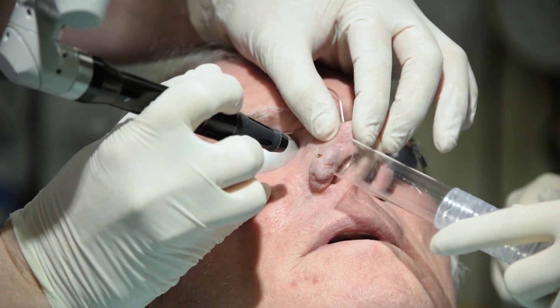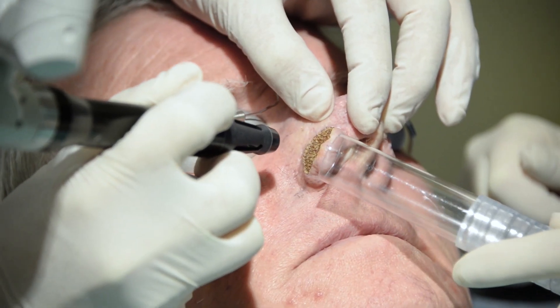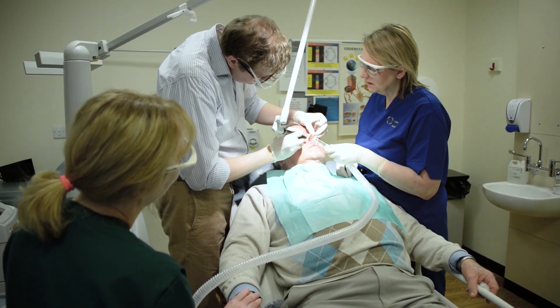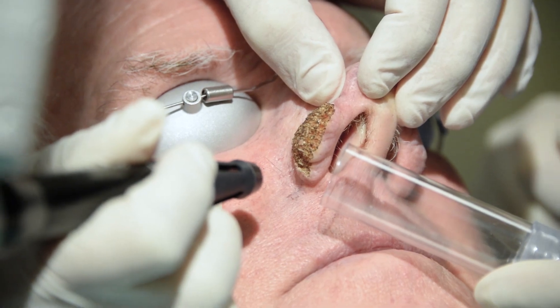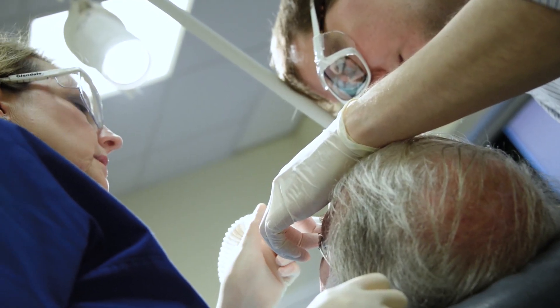The luminous carbon dioxide laser, aided by use of the plume evacuator, is then used to ablate the main bulk of the rhinophyma. This is achieved by selecting a 2mm TrueSpot handpiece on continuous wave settings.